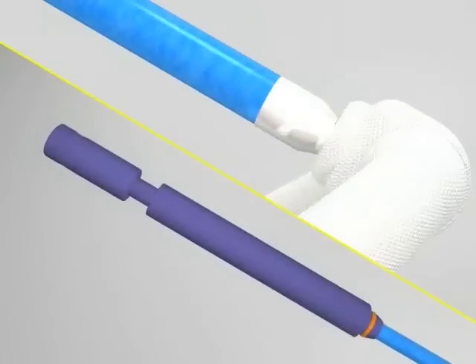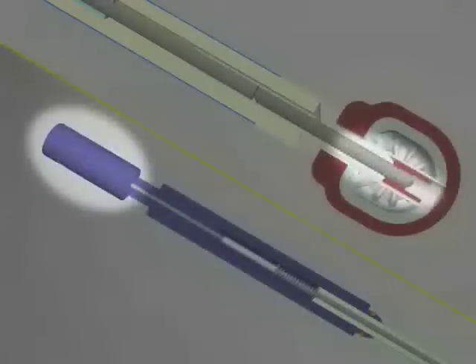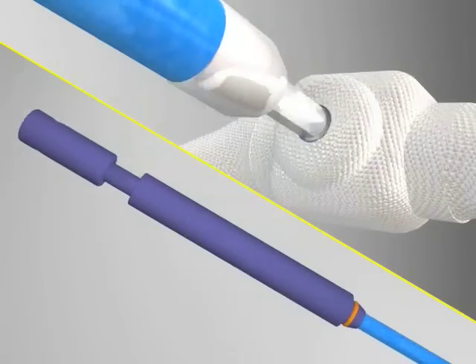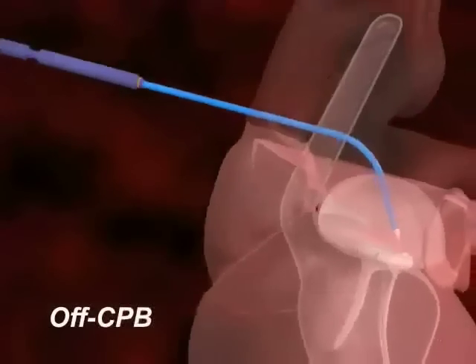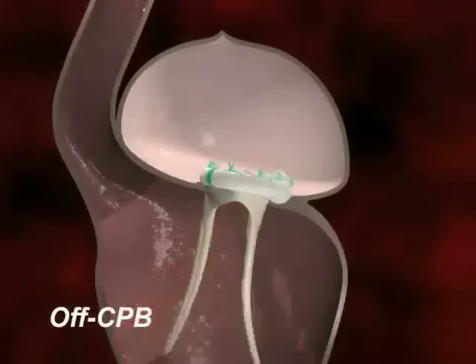As the surgeon rotates the rotating knob counterclockwise, the threaded engagement rotates counterclockwise and retreats through the threaded insert. When the threaded engagement is completely unthreaded from the threaded insert, the adjustment tool may be gently pulled free from the ring. The adjustment tool is then withdrawn from the atrium and the procedure is complete.